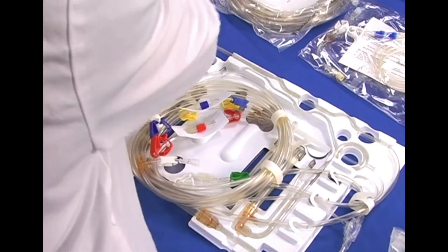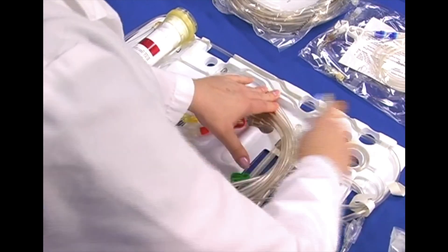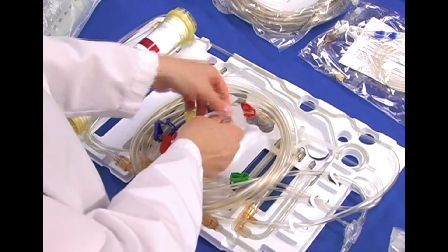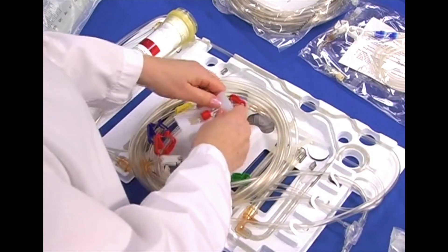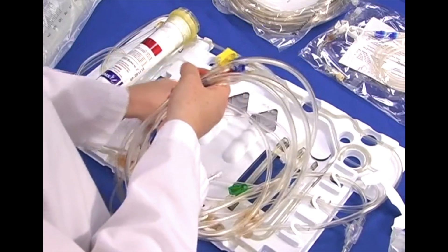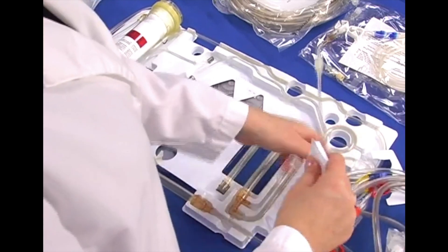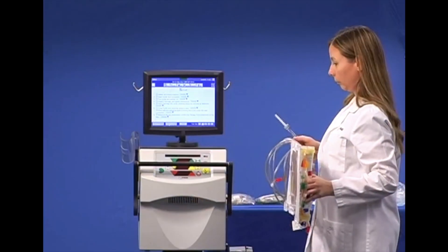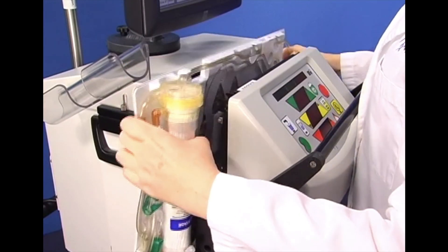Unpack the cartridge and tighten the patient line connections. Lift the priming spike from the cartridge and insert the cartridge into the cycler, and press the tubing into all three air detectors.